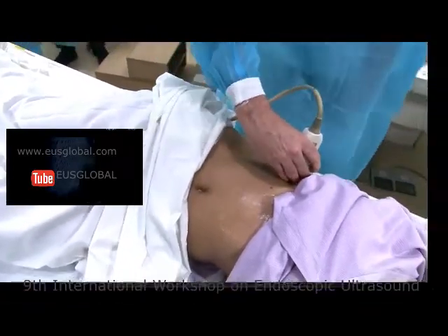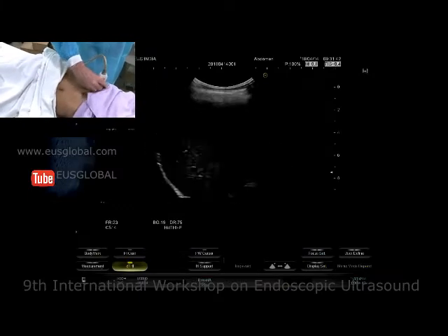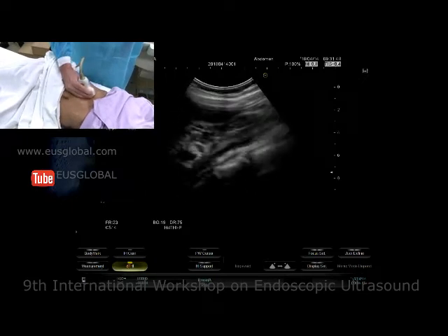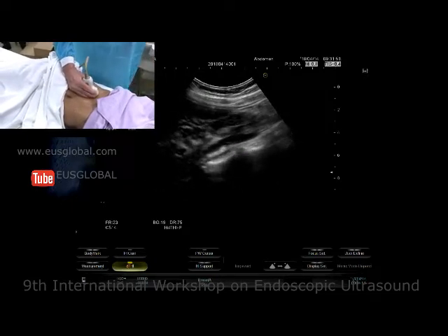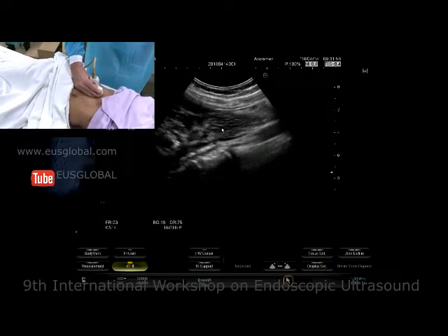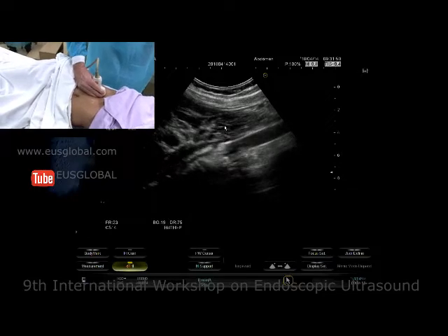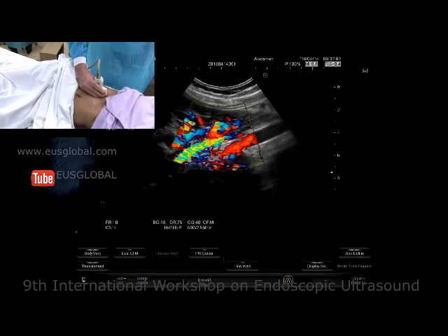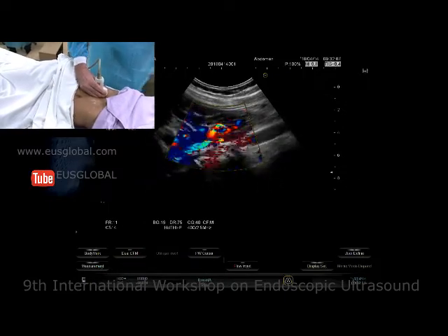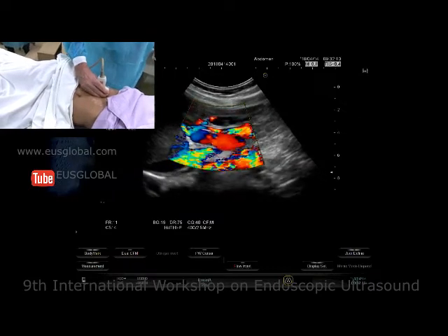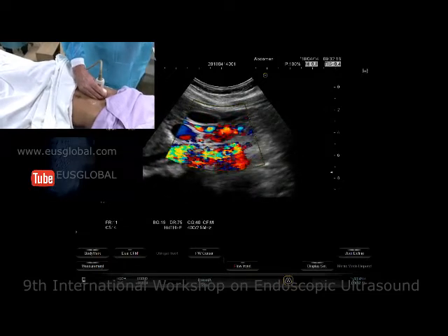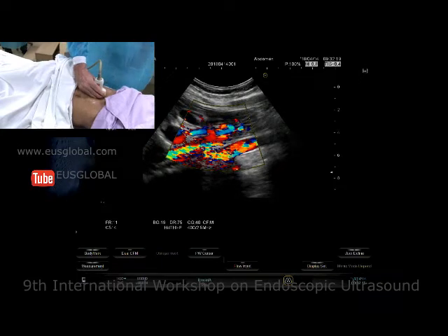From intercostally we will scan the portal vein and we are looking for collaterals. Here you can see quite nicely the liver hilum and you can see more vessels than expected. By putting in the color and lowering the velocity scale, we can nicely depict a huge amount of vessels in the liver hilum. So collaterals have been forming.